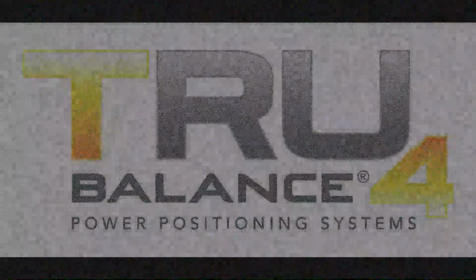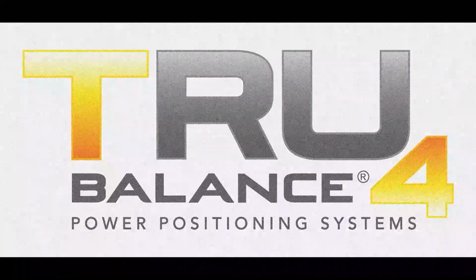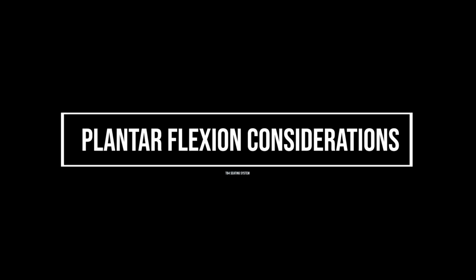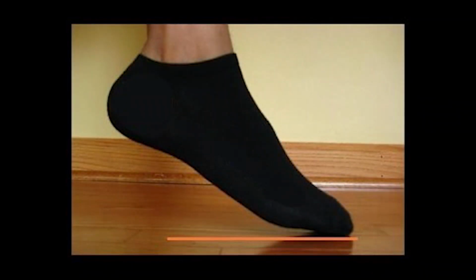In this video, we'll take a look at TB4 programming considerations for individuals with non-reducible plantar flexion. Plantar flexion is the downward movement of a foot away from the body. Here, we have a foot shown in a neutral position. Here, we have a foot shown in plantar flexion.